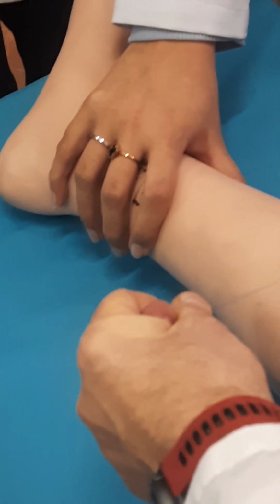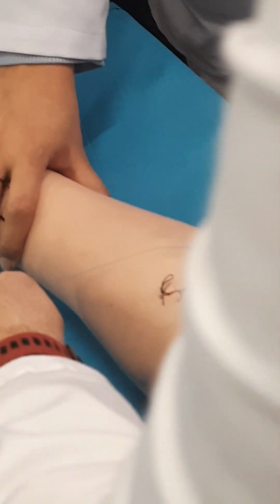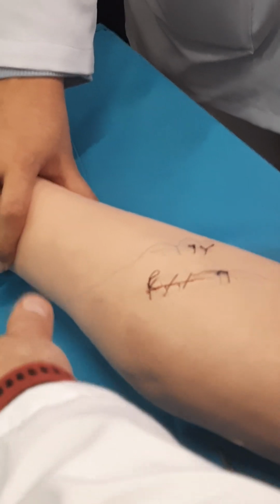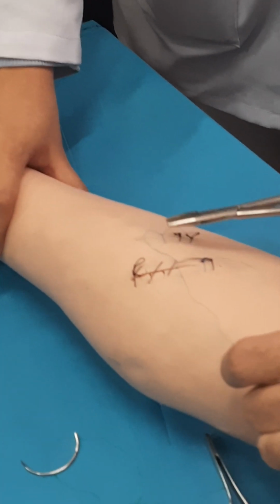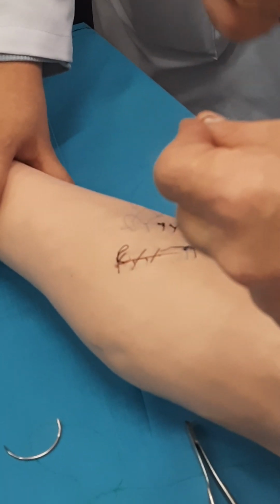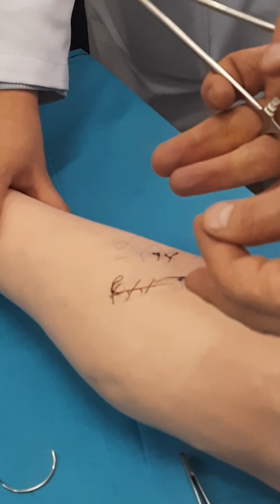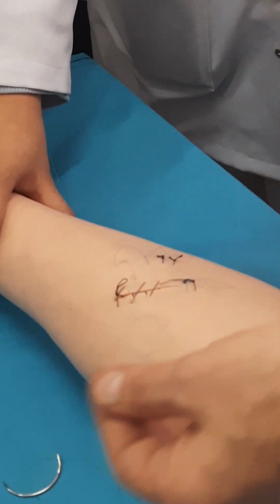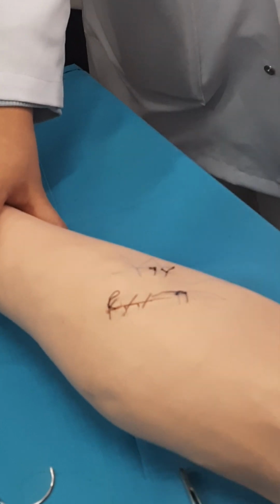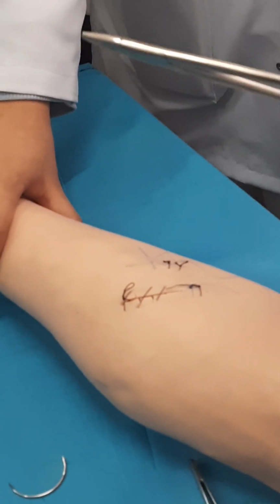And look what I'm doing. I apply the knot on the side of the wound, not in the midpoint, but on the side. If it is in the midpoint, it will irritate the margins. Then I open. Look, my margins don't disconnect, because this is not a thick and unmovable part of the skin. Vice versa, it is an elastic model, yeah? Now I release this pressure, and the margins are not disconnected. But imagine that you make a suture in front of the operator.